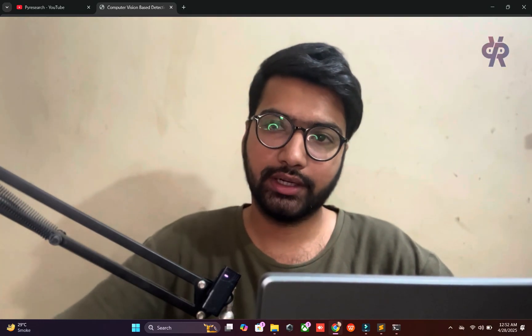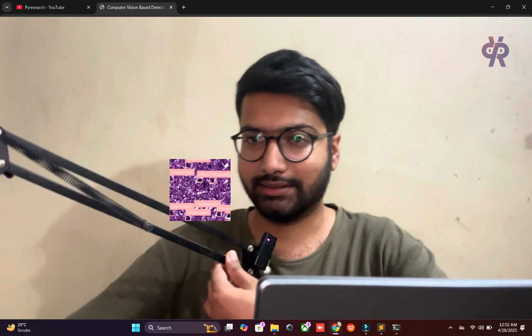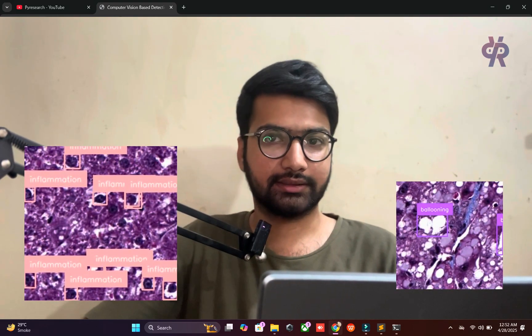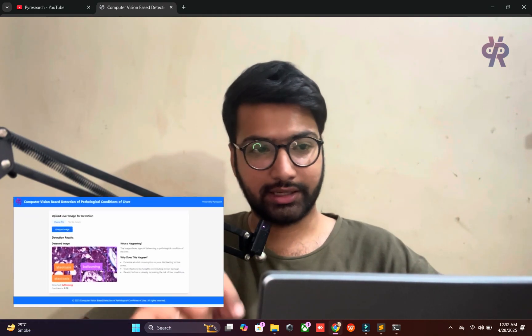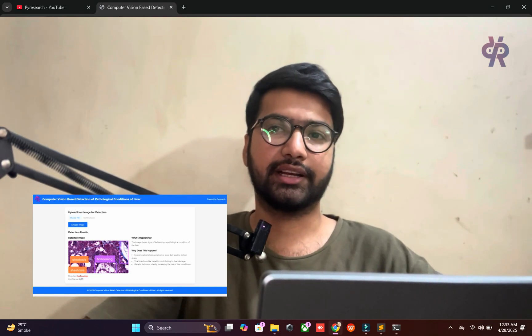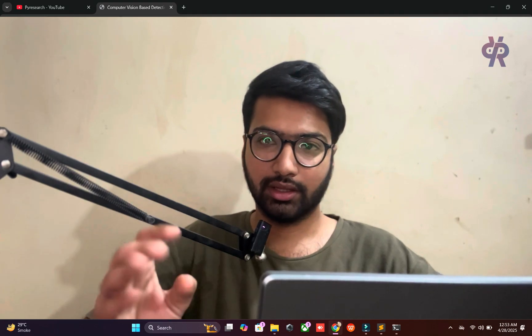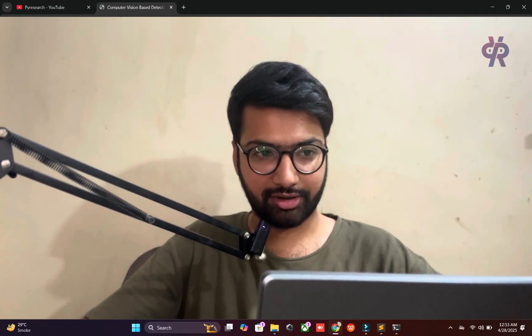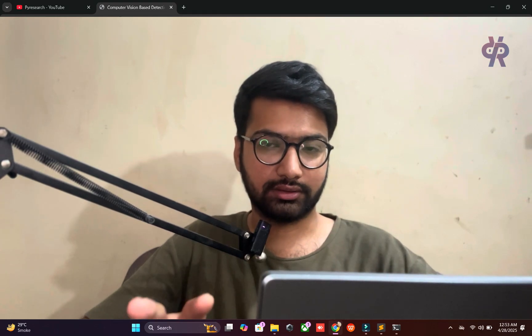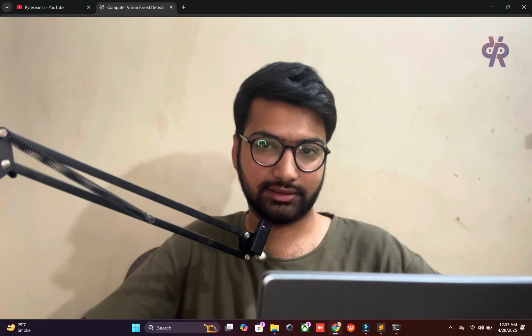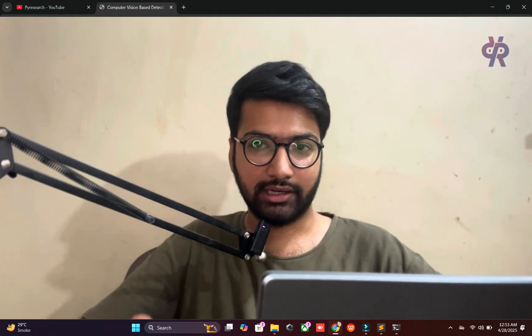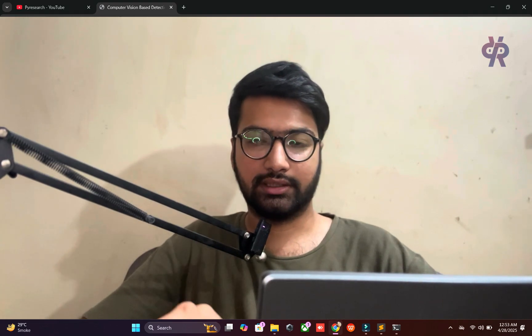Welcome to PyResearch channel. In this video we are going to explore image classification based computer vision for detection of pathological conditions of the liver — liver disease detection. We are targeting four categories, getting the dataset from an open source platform. We will build a liver condition classifier showing right and wrong results, along with suggestions about why the disease happens and how to control it.